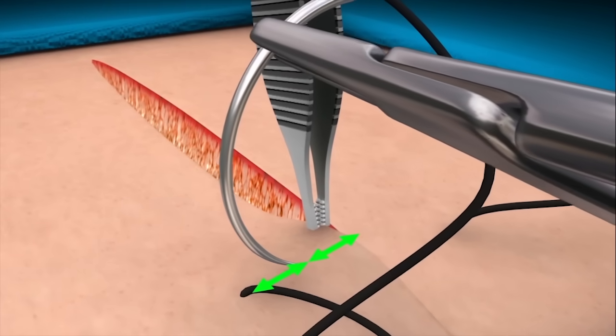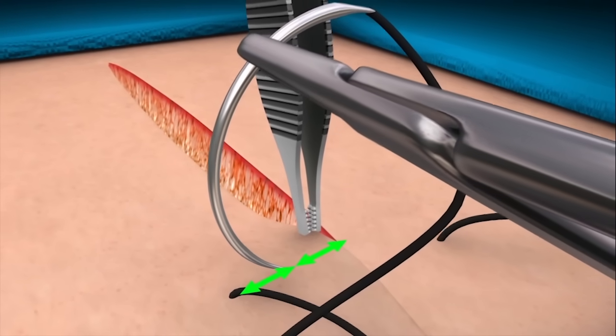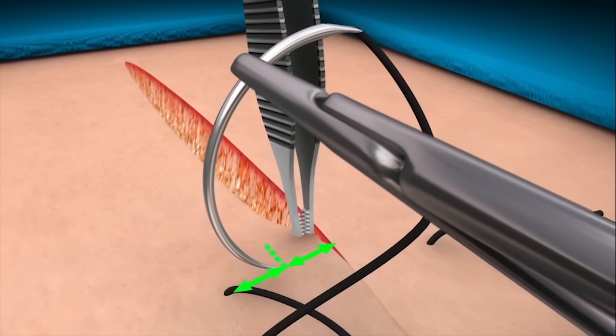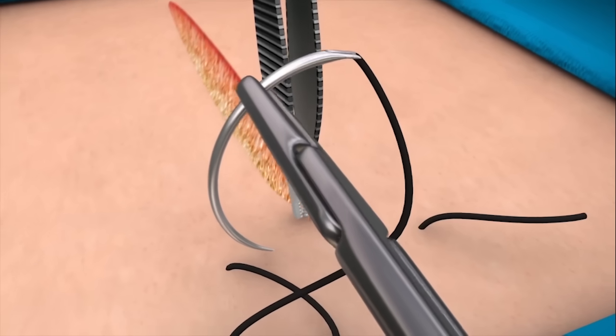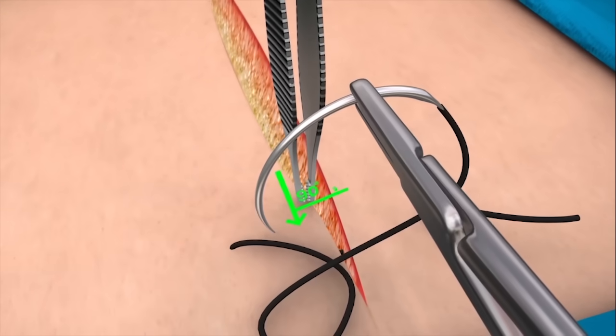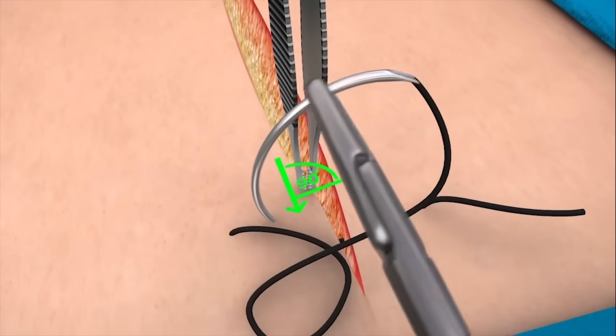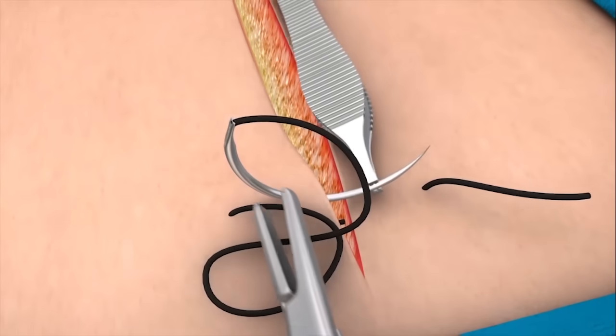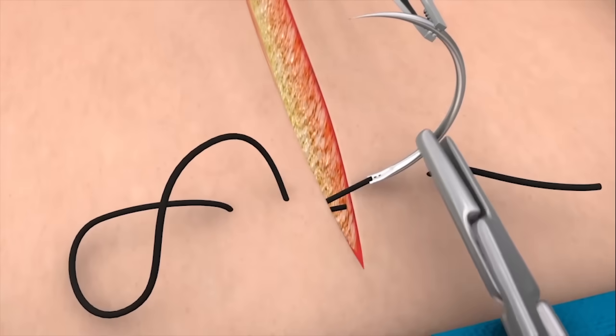Now take a small bite approximately halfway between the exit point and the skin edge. Using the backhand technique, enter the needle at 90 degrees to the skin and rotate the needle through the tissue by pronating the forearm.